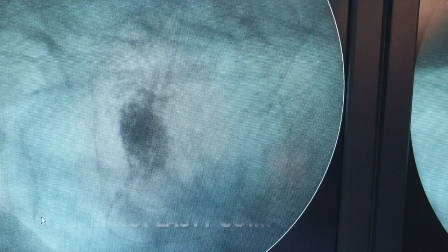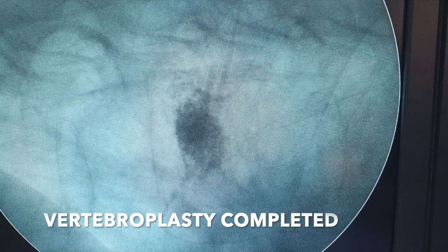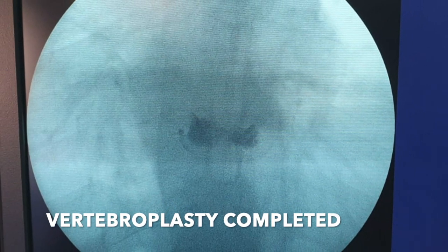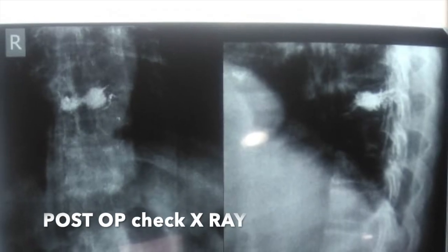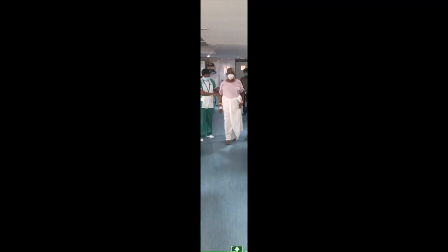The vertebroplasty is completed — shown in the lateral view, then the AP view. Post-op check X-ray is obtained.